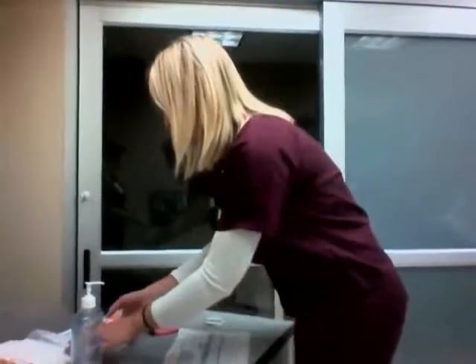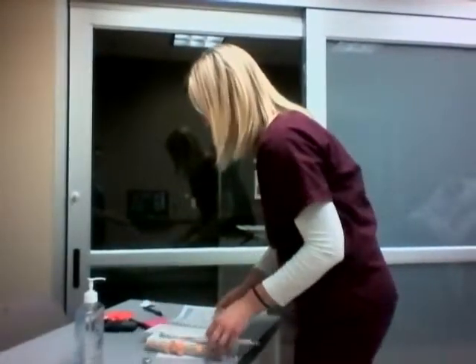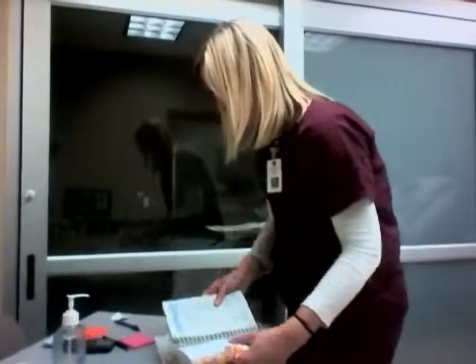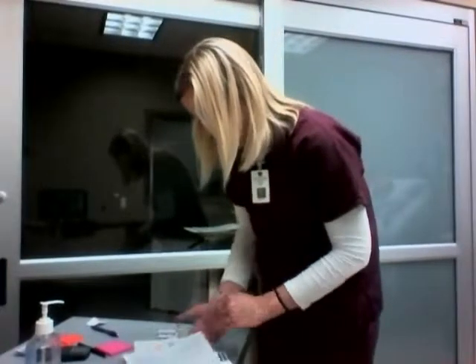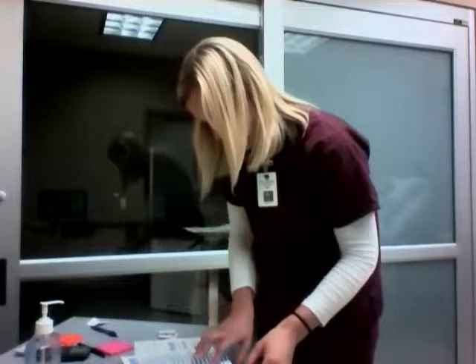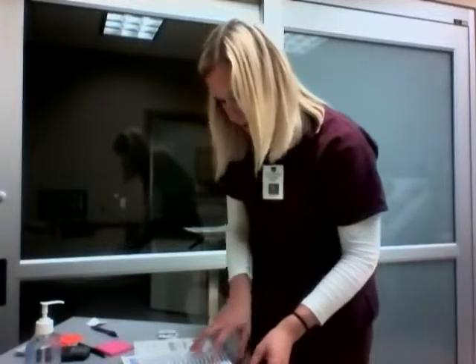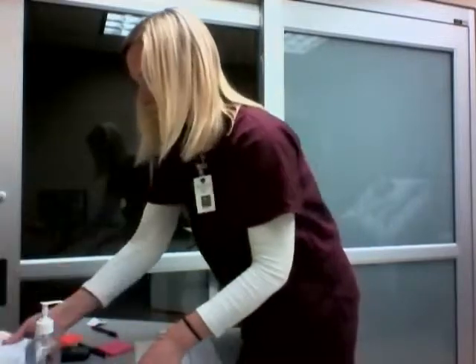And now I am going to look in my IV drug book, and I'm just going to confirm that this medication is compatible with the primary infusion that is running in the patient's room. And right now she has normal saline running. So I'm going to look in here, and it looks like it can be given undiluted through the Y tube with normal saline. So we'll go ahead and do that after I draw it up here.